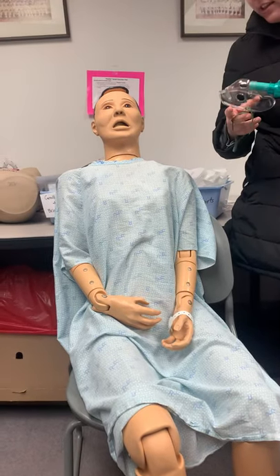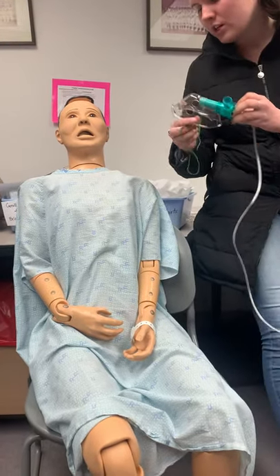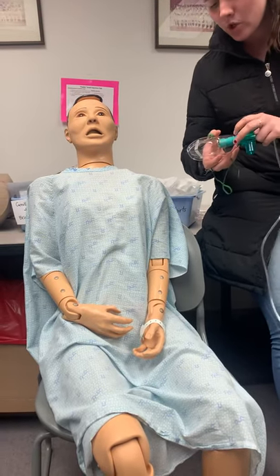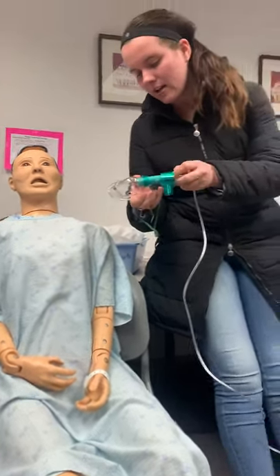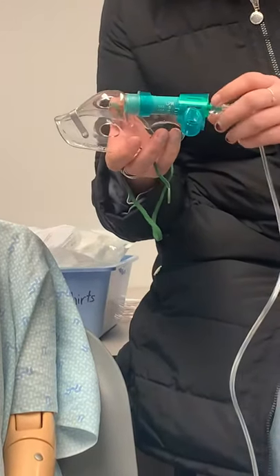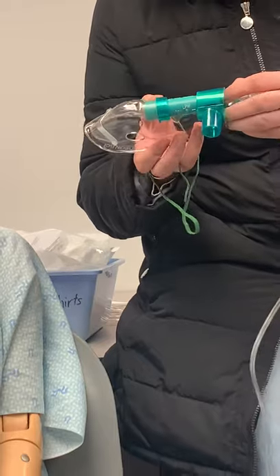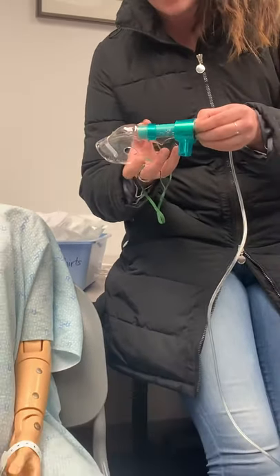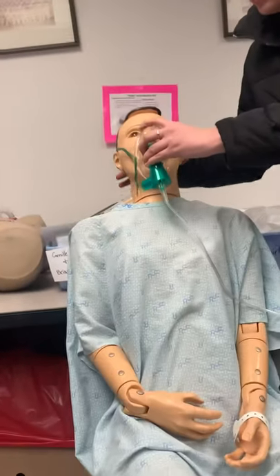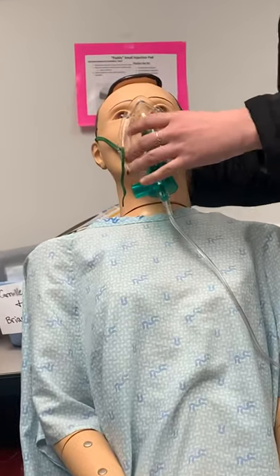Hi sir, today I'm going to be applying this high flow oxygen device to you because it looks like your oxygen is pretty low. This is called a Venturi mask and it has a dial on it that allows me to change the amounts of oxygen that are going through the mask. We're going to start you on a low one at 3 liters per minute and it's going to allow you to have 24% FiO2.